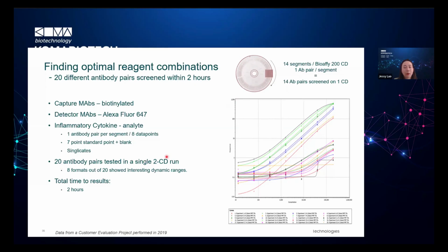And although the time is quite fast, another good point is that if we use ELISA to screen different reagent pairs or antibody pairs, you need to pipette different pairs of reagents manually. So you need to do the different combinations by yourself. But if using Gyrolab, you just need to place your maybe 5 or 6 different antibodies into different wells of the 96 plate.